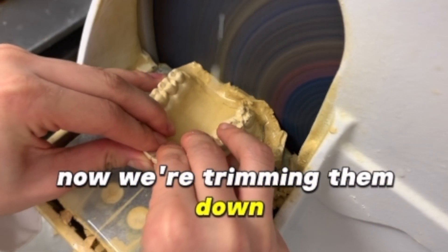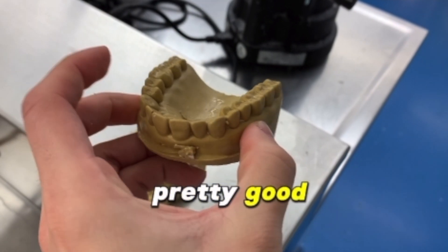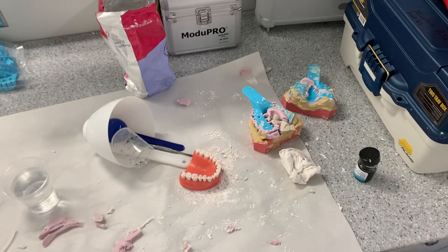Now we're trimming them down, looking at the flat edges. Pretty good — and that's the aftermath.